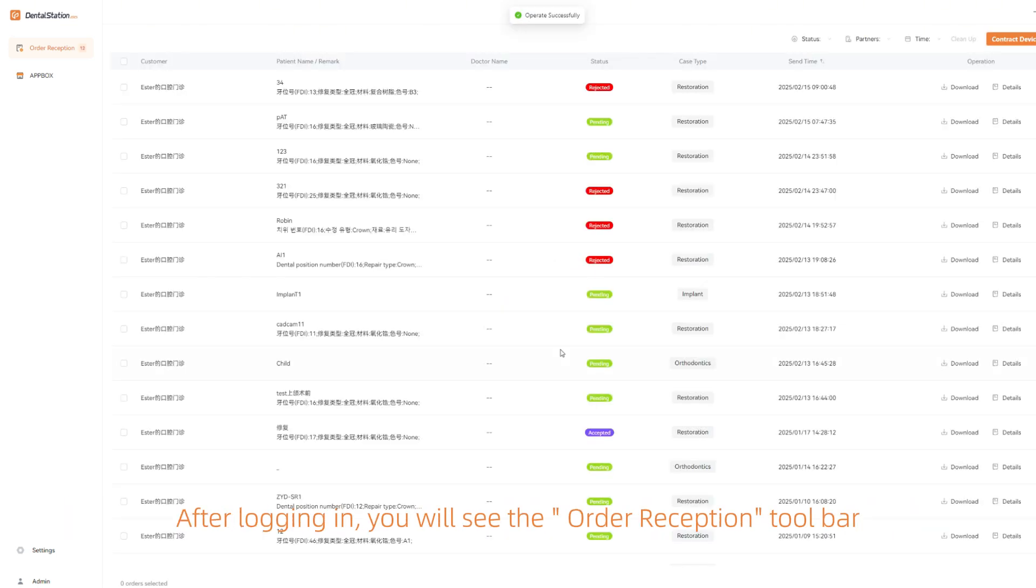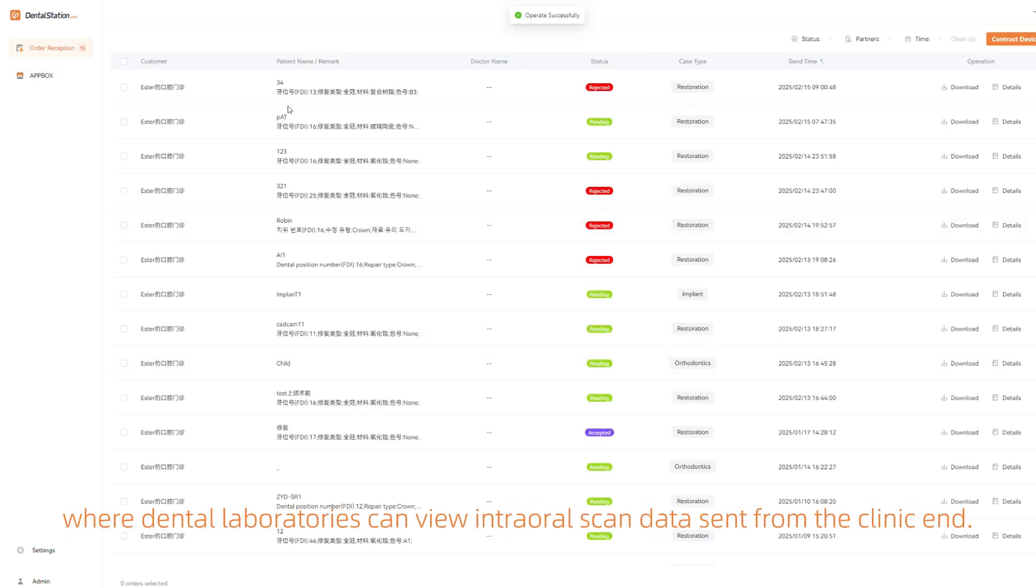After logging in, you will see the order reception toolbar where dental laboratories can view intraoral scan data sent from the clinic.